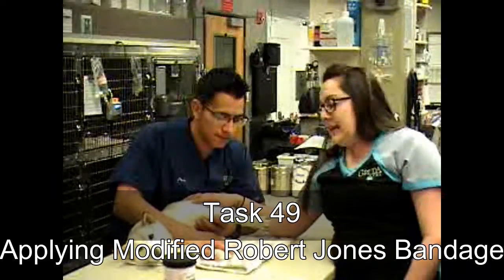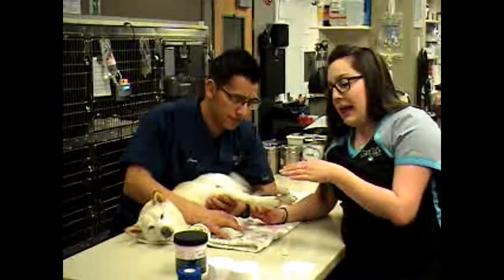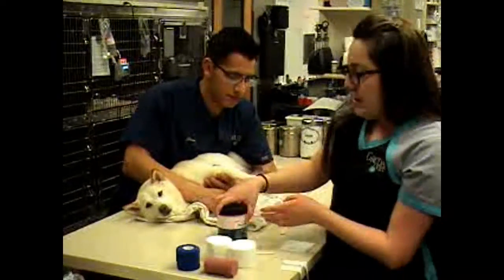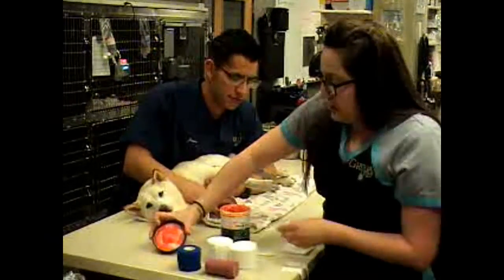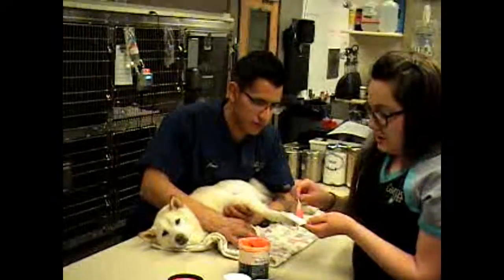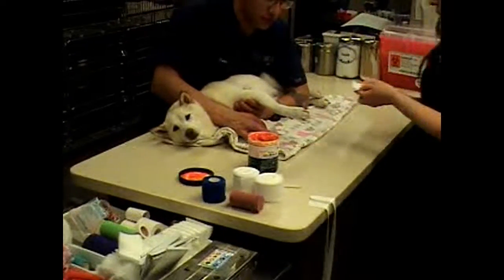So you've got Atlantic here — she's got some wounds on her paw pad, so we're going to apply a modified Robert Jones to this front limb. We've got some nitrofurizone, which we've mixed some scarlet oil in, and we're just going to apply a little bit to some 3x3s to help with wound healing before we put on the bandage.